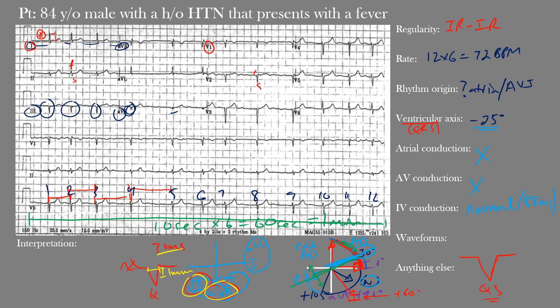Because we have pathological Q waves in leads III and AVF, there is evidence of a possible prior inferior infarction. T waves are present, asymmetric, and appear normal. The PR segment and interval cannot be assessed without visible P waves. The overall QRS interval and amplitude are within normal limits. The ST segment does not appear significantly elevated or depressed anywhere on the EKG, and the QT interval appears within normal limits.